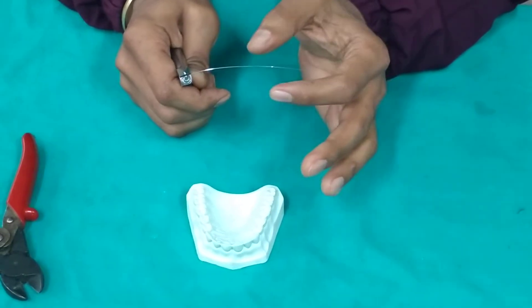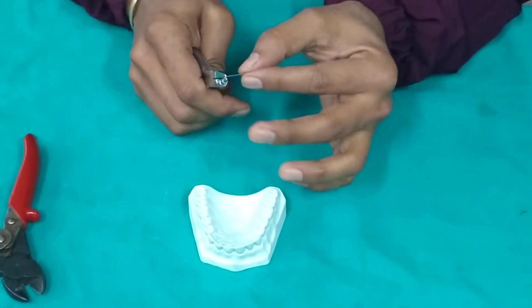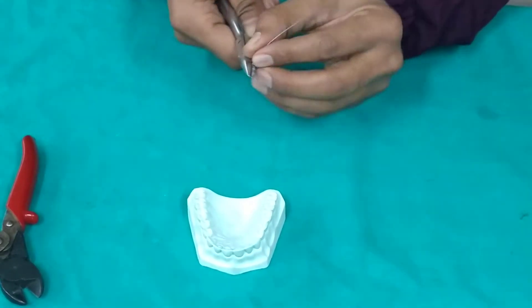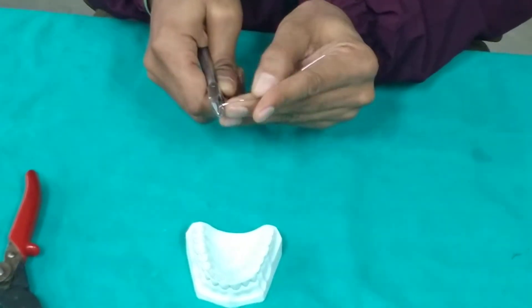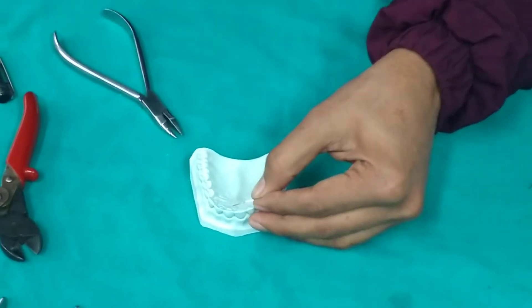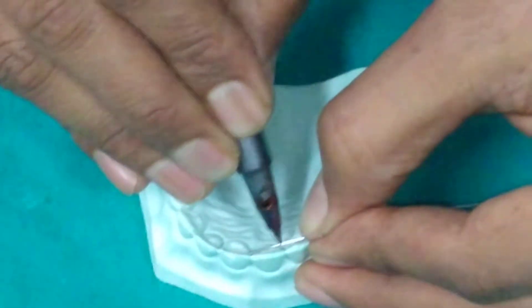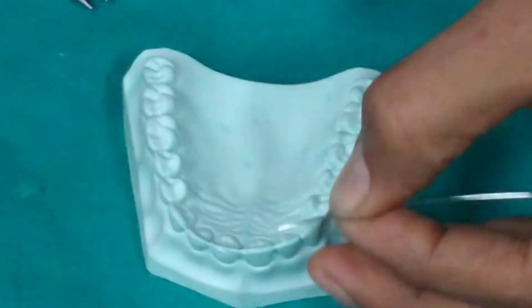We cut a small segment of 0.5 mm stainless steel wire and slightly straighten it up. After straightening the wire, we mark the mesiodistal width of the tooth.